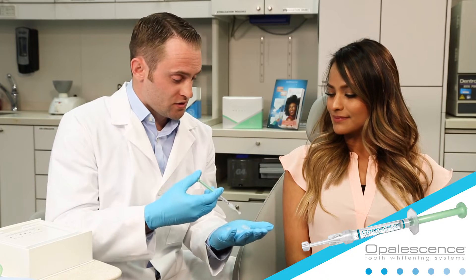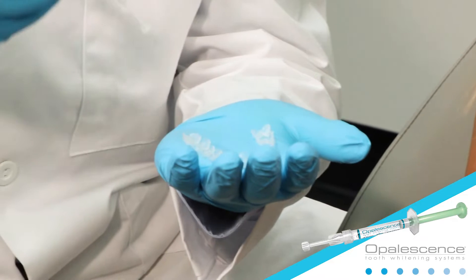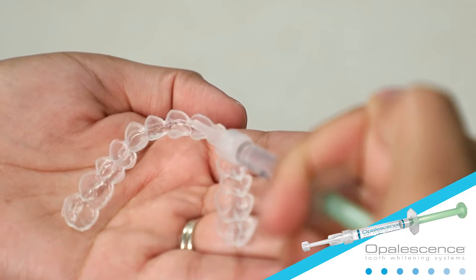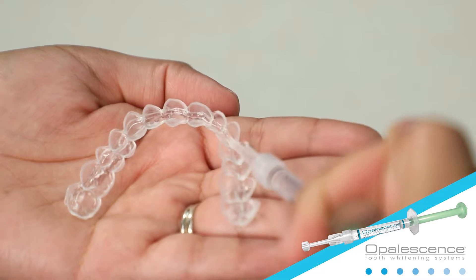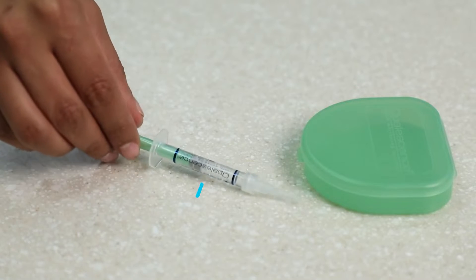To load whitening gel in your custom tray, begin by expressing one continuous bead of gel approximately halfway up from the chewing surface on the front side of the tray, from molar to molar. This should use about one-half to one-third of a syringe in each tray.